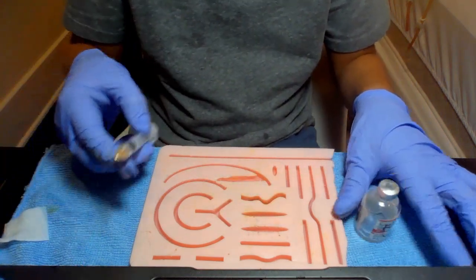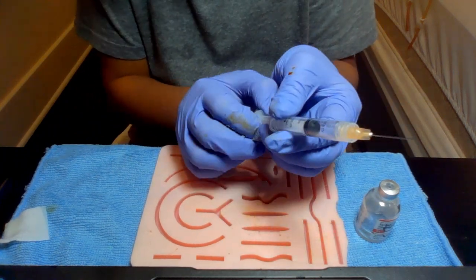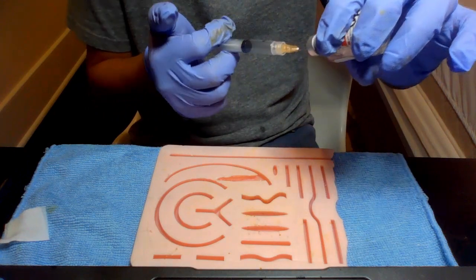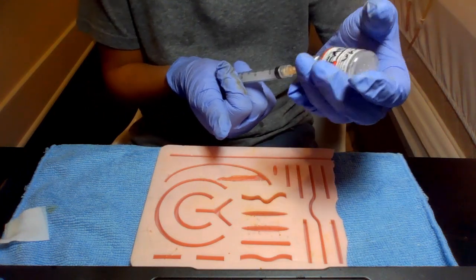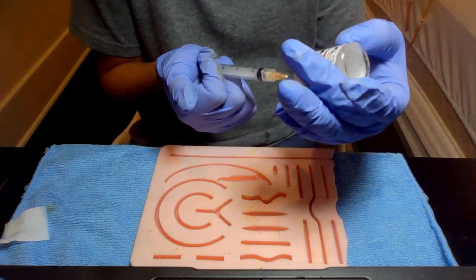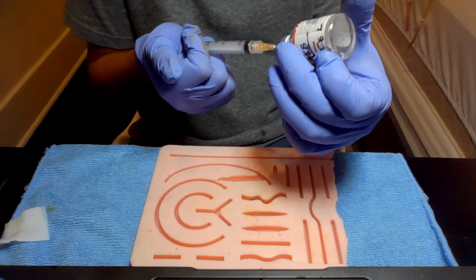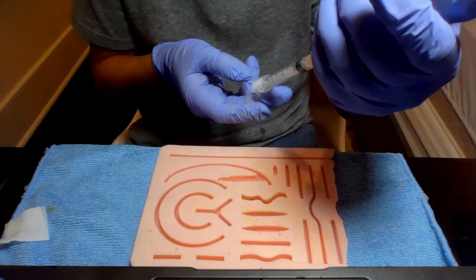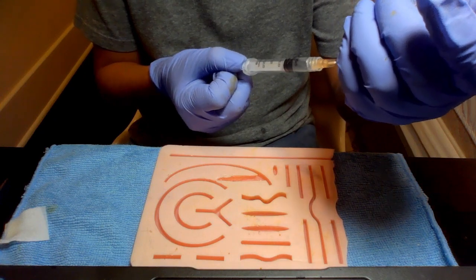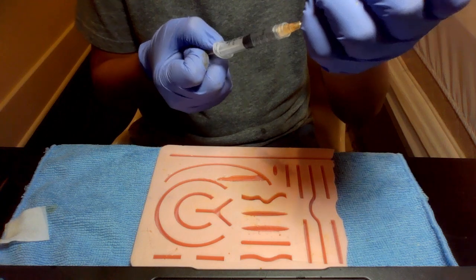Now we're going to take our syringe and put a little air in it to increase pressure in the vial. Then I'm going to hold it upside down. I'm going to look at the medication to make sure it's the correct medication that I'm giving, and make sure the expiry date is valid. I'm going to hold it, and do my best to not touch the area. We're going to draw up the medication.